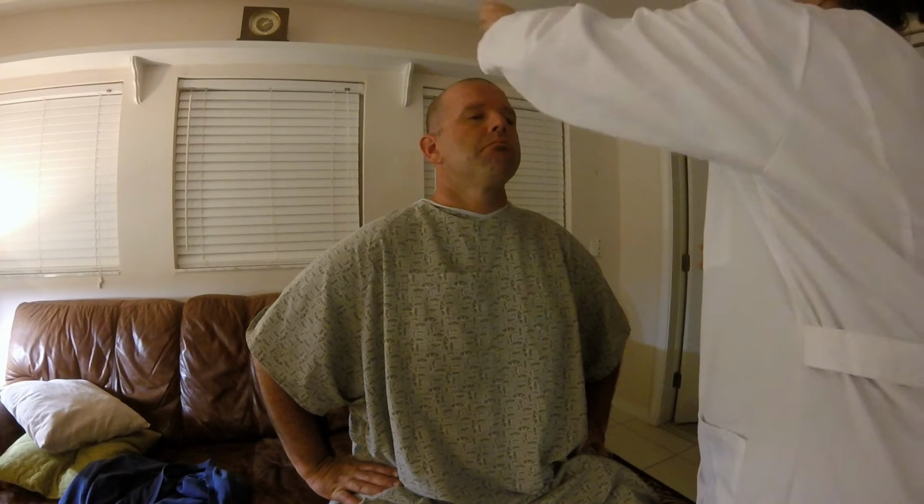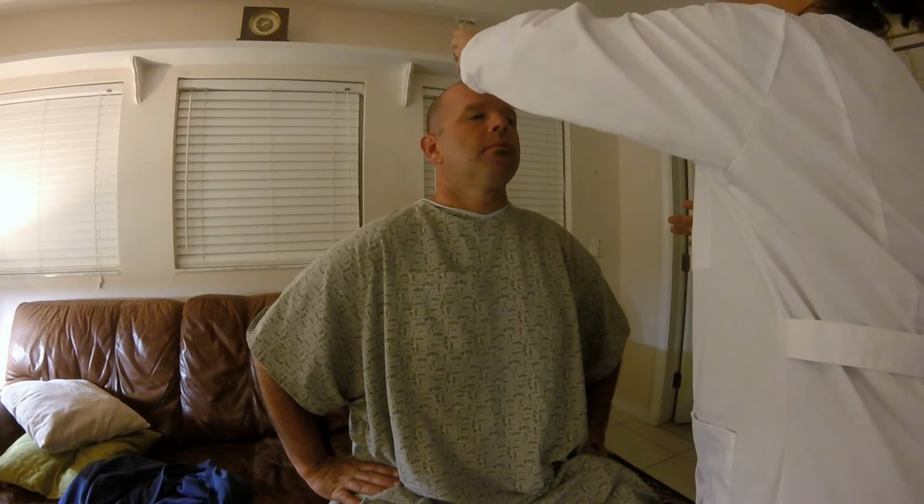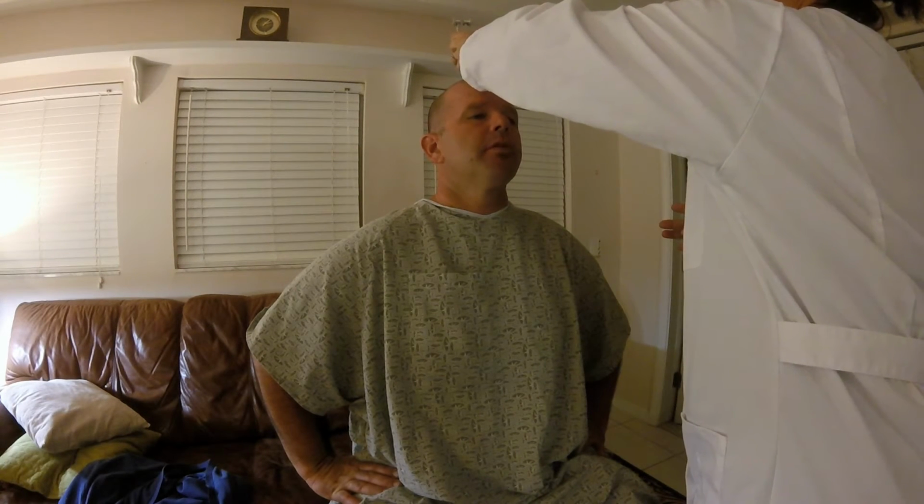We're going to do a couple different hearing tests. The first one being the Weber, and this is with my tuning fork. Sir, when I strike this, it's going to make a ringing noise. I need to know if you hear it in one ear, both ears, or not at all. Okay? Do you think you can help me out with that? One more strike. I hear it in both ears. Okay, great. Now the next test is going to require me to set a timer. So please just tell me when you don't hear this anymore.